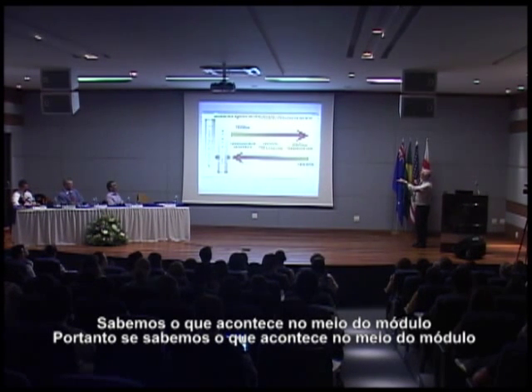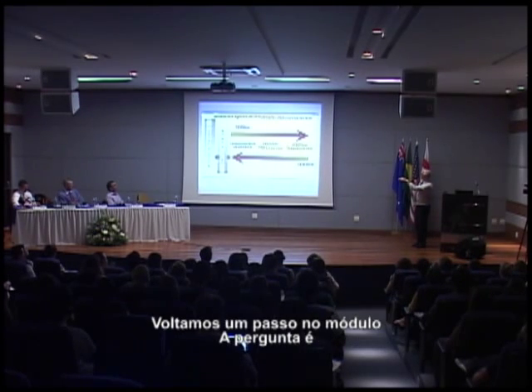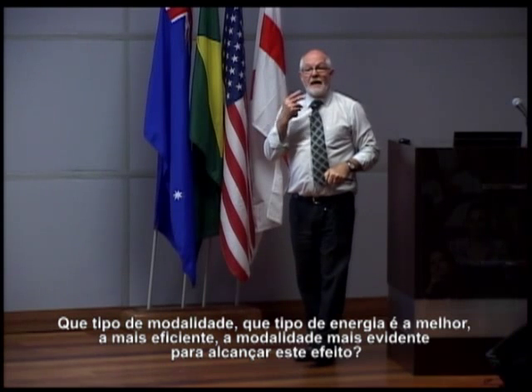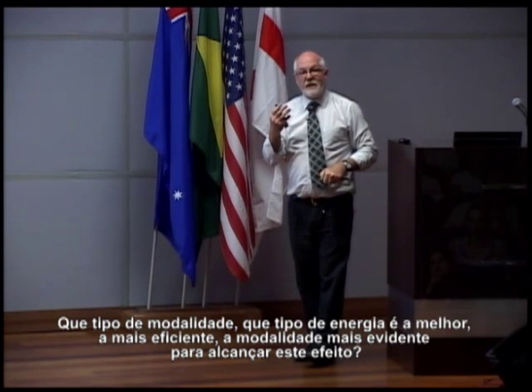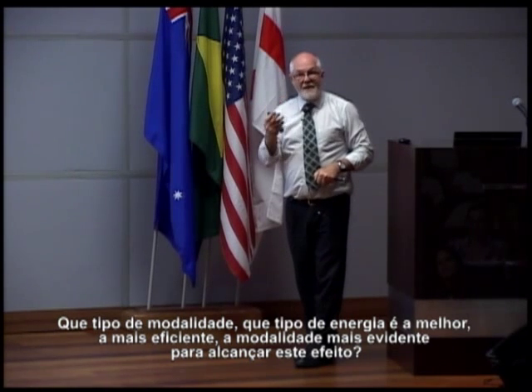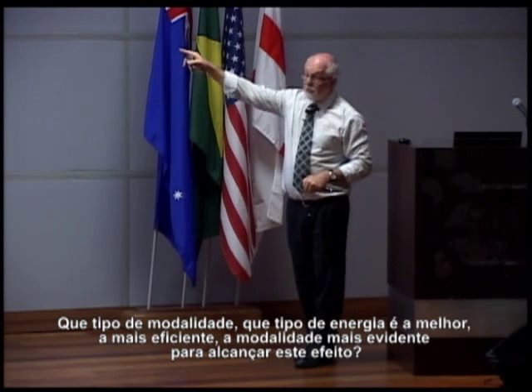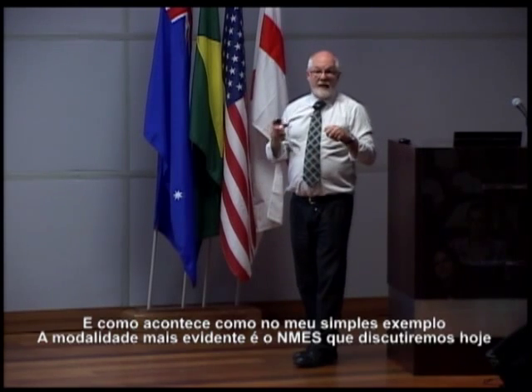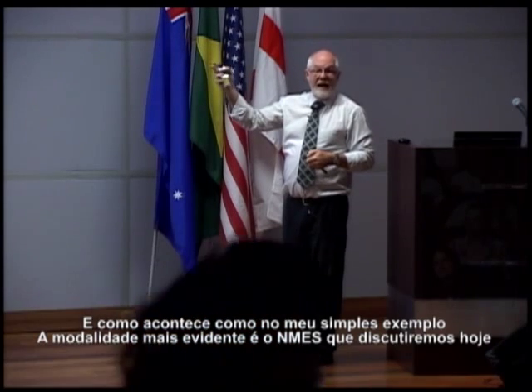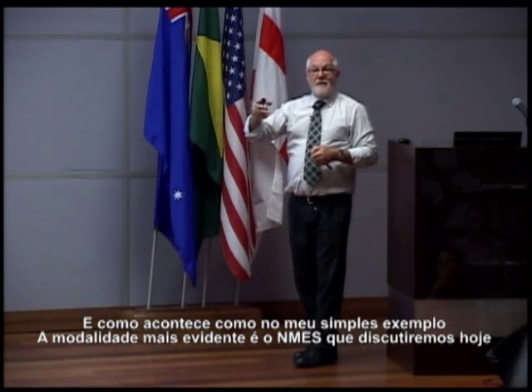So if we know what happens in the middle of the model, come one step back through the model, the question is which modality, which type of energy is the best, the most efficient, the best evidenced modality to achieve that effect. And as it happens with my silly example, the best evidence modality is NMES.